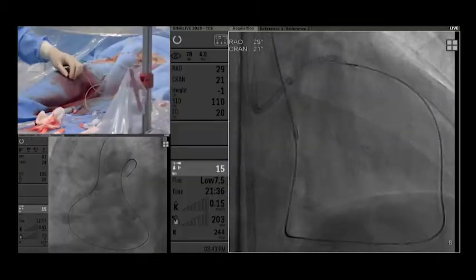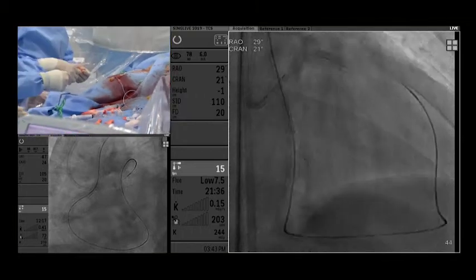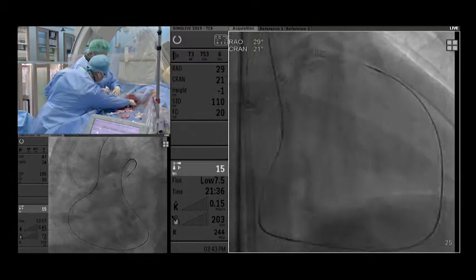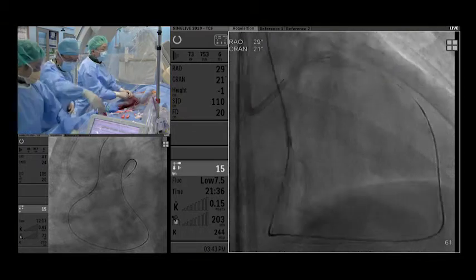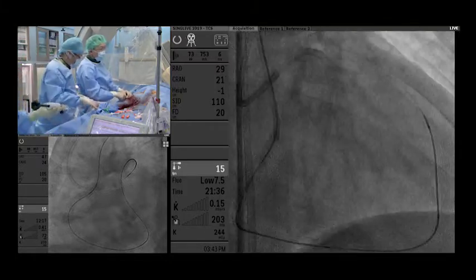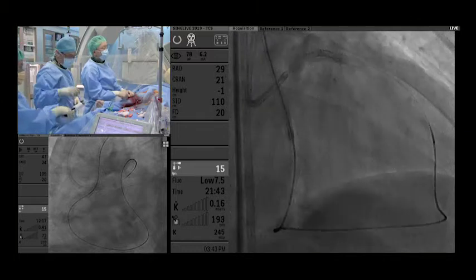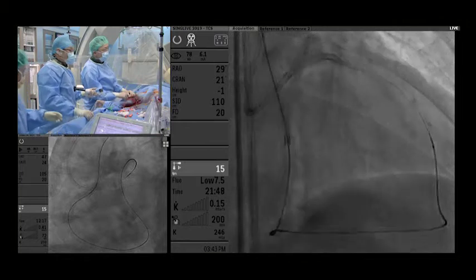Okay, 2.5 balloon. But the other interesting learning point from here: I made antegrade dilatation, initial crossing, and made IVUS examination, again, and put the stent. He got into the main vessel, but then it went out again proximally. Then he changed to a softer wire. I thought that was an interesting point because these stiff wires tend to go straight, and as you said, the LAD isn't really that straight. Slight bend. So with a very straight wire, you're likely to go in and get out again in the proximal part. So using a more controllable softer wire may actually be to your advantage.